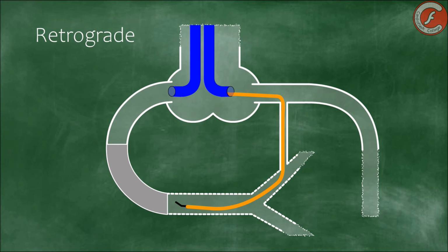The objective is to luminally cross the occlusion from distal to proximal and posteriorly advance the guide wire until it gets into the antegrade catheter, where trapping occurs. That is, we trap the guide wire with a balloon with the purpose of generating enough support so that the retrograde microcatheter advances. Sometimes it is not possible for the guide wire to get into the catheter, and it is necessary to hunt the guide wire with a lasso in the aorta.